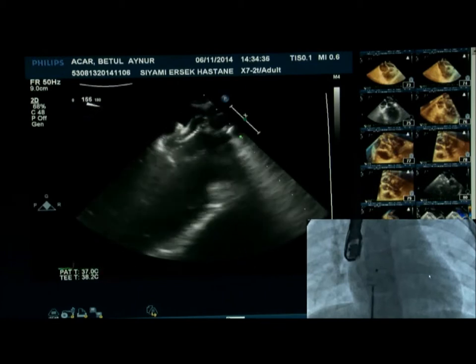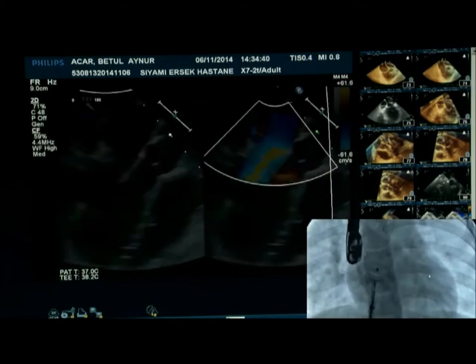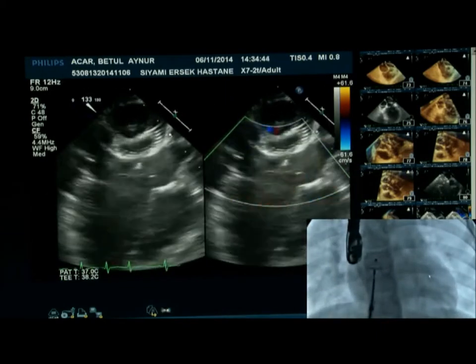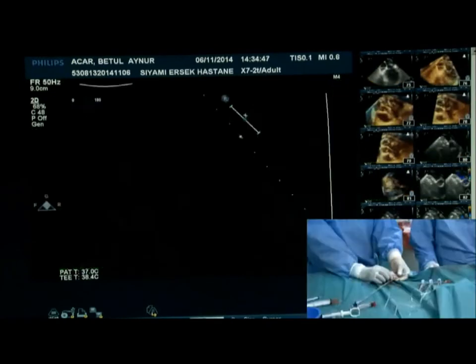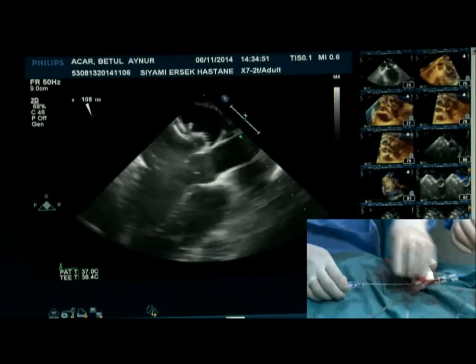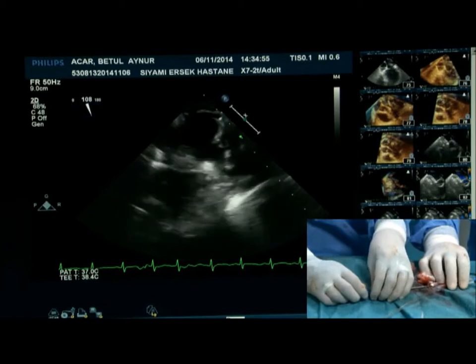Okay, so I think it's a little oversized, but I'm comfortable with that, a little oversizing of 18 millimeters. So I'm not going to do any tugging or anything, if that's all right with you. It's fine with us. And then we'll release it. So if we do a cine. Okay. So, the audience doesn't agree.